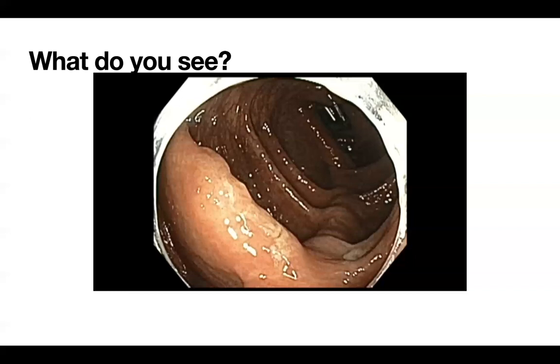Which means that a third endoscopy, say for piecemeal polypectomy, a check endoscopy to see the adequacy of resection, will be the time to make sure that nothing else is remaining. Otherwise, we end up either ignoring one of the important factors, or spending too much time doing the rest of the screening and finding other polyps, and then the major polyp takes more time. So balancing of time becomes an issue. But while balancing of time is our problem, a clean colon without any further polyps is the patient's goal.